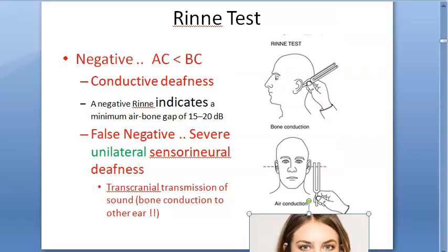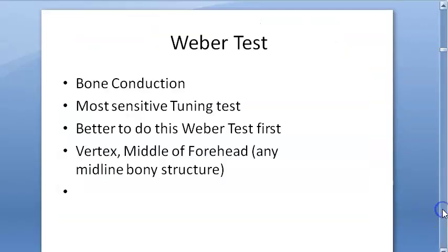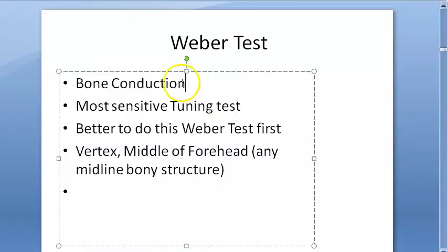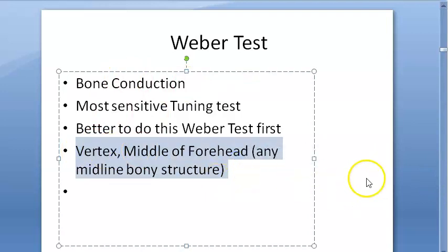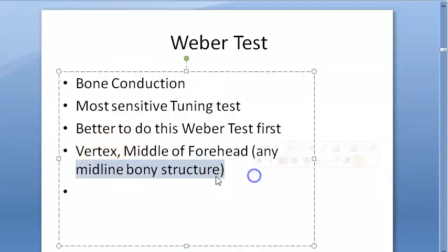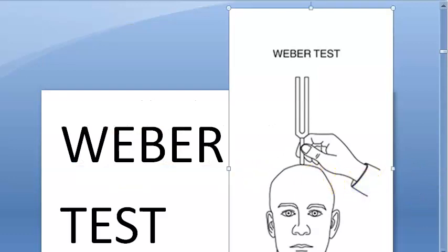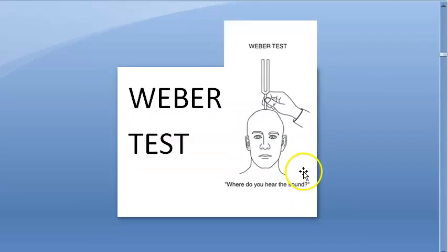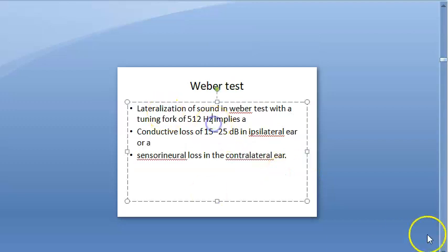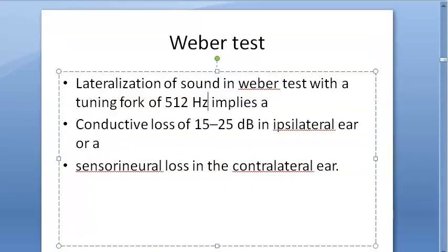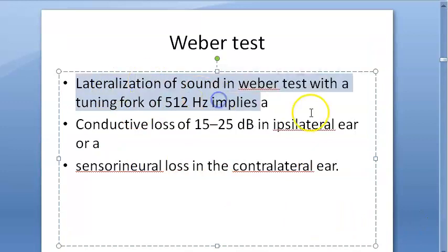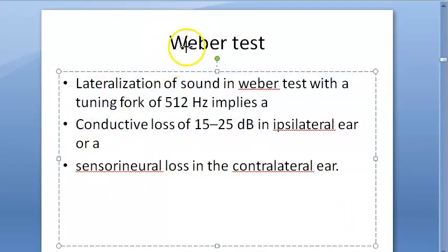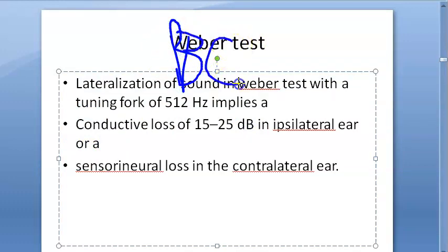The next hearing test is Weber's test. You keep the tuning fork on the vertex, the middle of the forehead, or any midline bony structure. This is said to be the most sensitive tuning fork test. Normally, both sides should hear equally, but if there is lateralization, one ear hears better than the other.